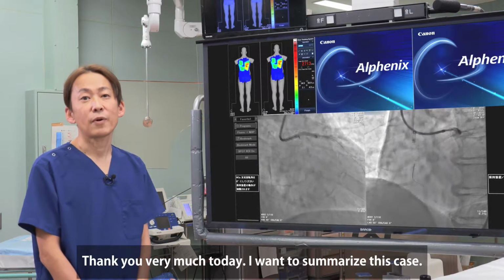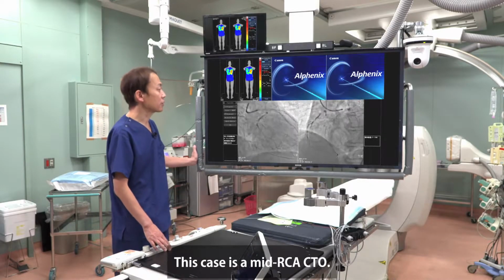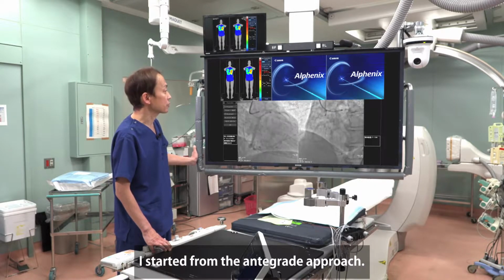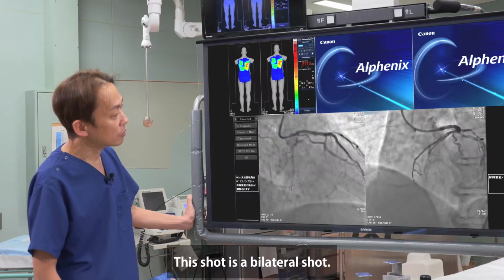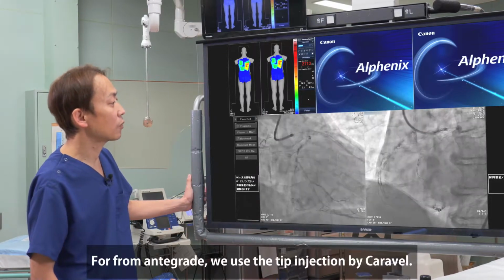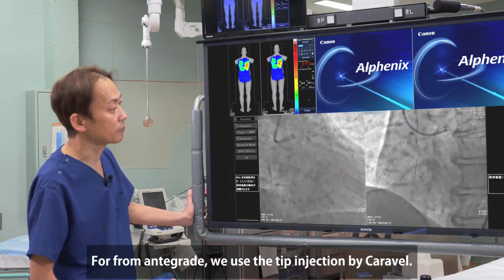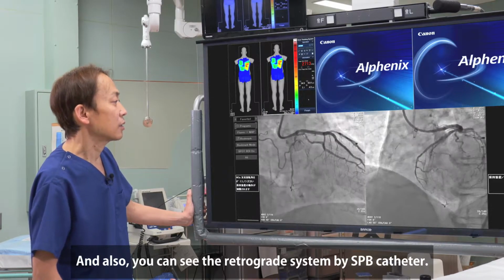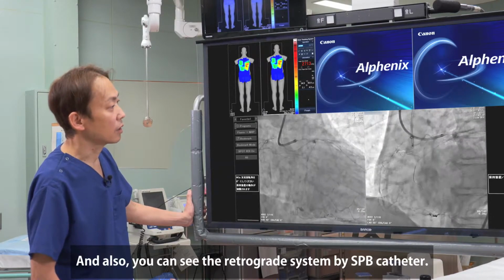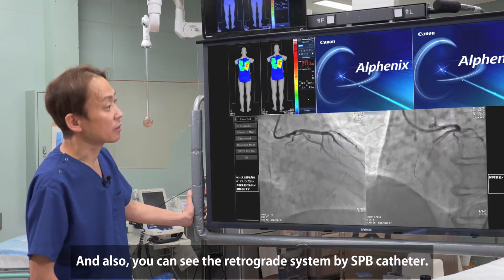I want to summarize this case. So this case is the mid RCA CTO. So I started from the antegrade approach. So this shot is a bilateral shot. So from antegrade, we use the tip injection by Caravel. And also you can see the retrograde system by SPB catheter.